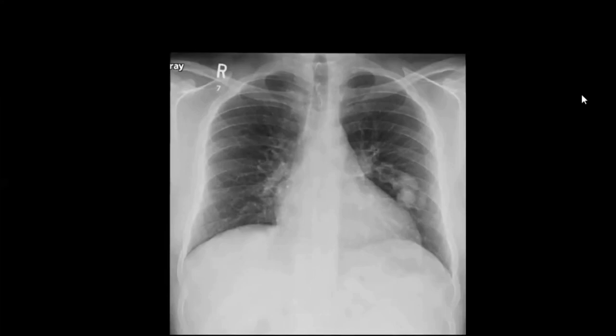Later on, we had this chest X-ray of the same patient. Can you appreciate something on this? As I told you initially, in the part two exam, for the cases which are shown to you, you have to make a diagnosis out of the images provided most of the time, or you have to reach a close differential. At least there should be a logical approach to your interpretation of images. Like I said, in young patients, whenever you see intraparenchymal hemorrhage, you have to find an AVM with that. On CT images, you cannot find that because the vessels go into spasm and there is an acute bleed.